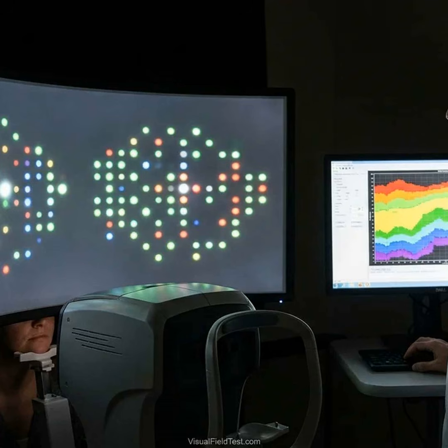A prospective study followed ocular hypertensive glaucoma suspect eyes for 3 years with matrix FDT and conventional perimetry. It found that more eyes developed visual field defects on FDT, 8%, than on standard testing, 6.2%. Importantly, the study concluded that FDT often detected defects that were not evident on SAP at the same visits. In summary, temporal contrast tests, flicker, CFF, FDT, are sensitive to early glaucoma and provide a complementary view of vision loss.